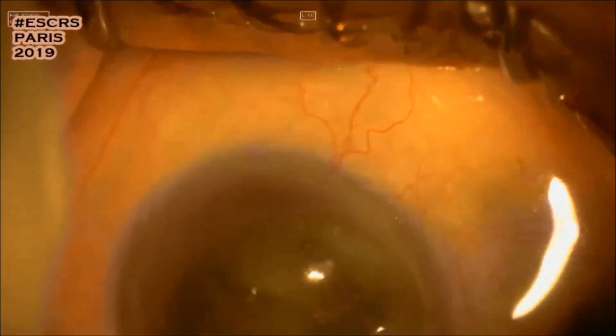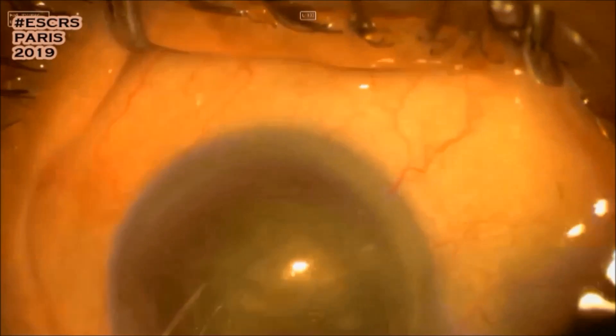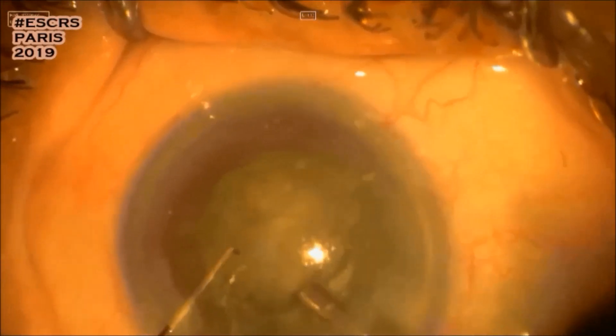More phaco power and the lens is cracked. Making sure of full separation of the two halves.